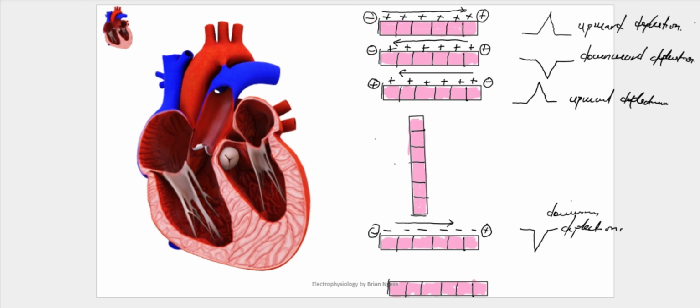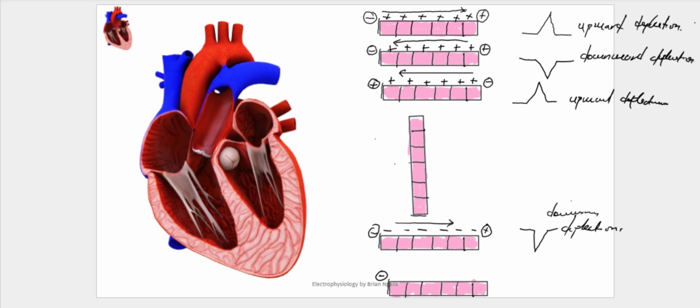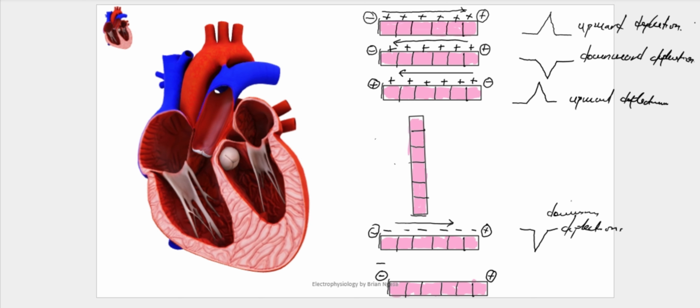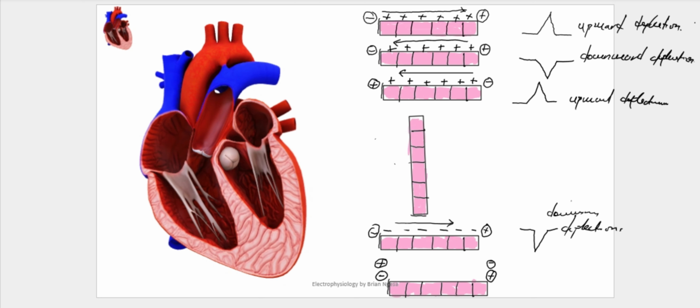It is also good to note that there comes a time where you can place maybe a negative electrode over here, or let's even decide positive. So let's just create two scenarios at a go, and maybe alternatively somebody else decides to place a positive over here and maybe negative over here. So these are two scenarios that we want to explain at a go.